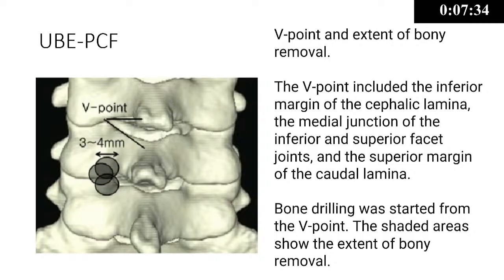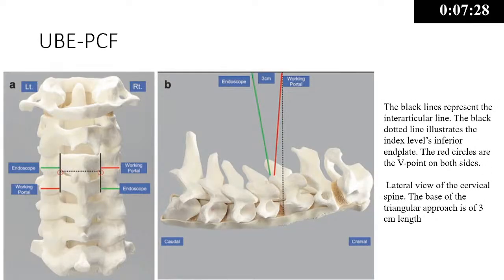After docking, we remove about 3 to 4 mm of the bone, so that we can have a wider foraminotomy and decompress the neural elements. I think the biportal endoscopic port is around 4 mm. So we can go one up and one down, to cover that level.